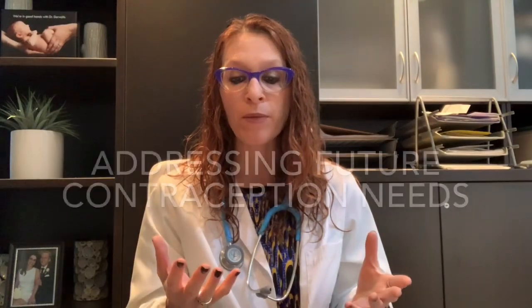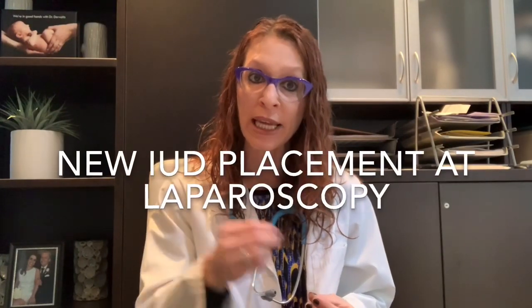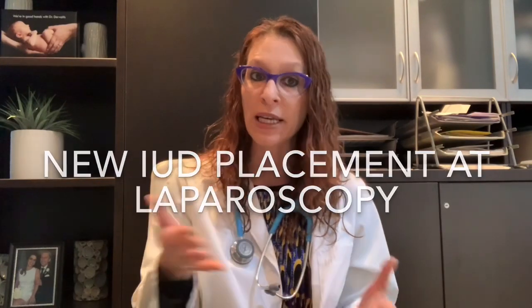Now, in terms of future contraception in someone who's had a uterine perforation because of an IUD, I do want to note that some patients will actually elect to have a new IUD placed at the time of the laparoscopy, because in that situation we are able to do the insertion where we can visualize the top of the uterus and ensure with our own 2 eyes that there's not any sort of a perforation situation. So having a new IUD placed is a possibility, and having one IUD perforation does not necessarily mean that a perforation will happen again if you choose to continue to use an IUD for contraception.